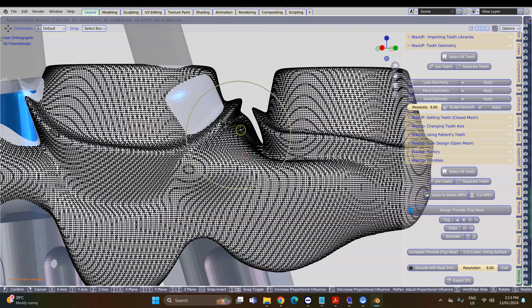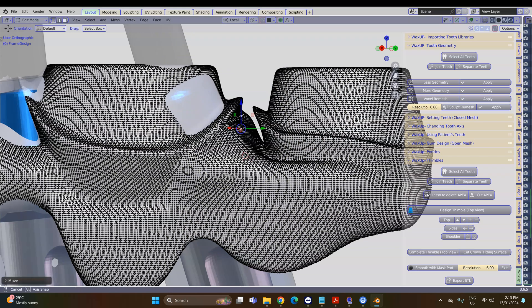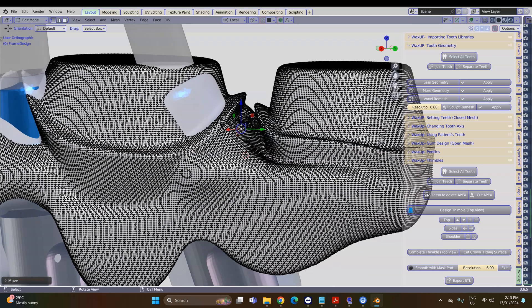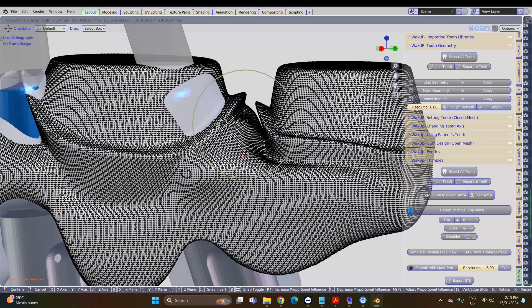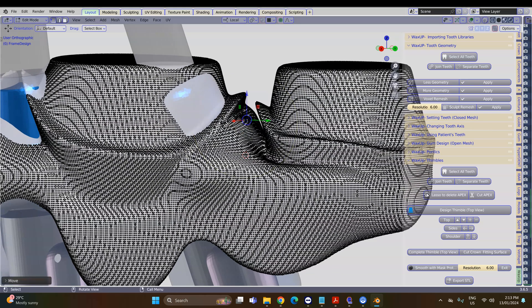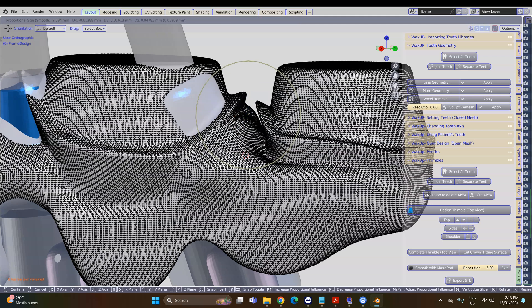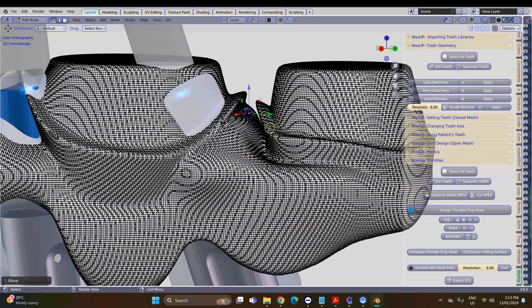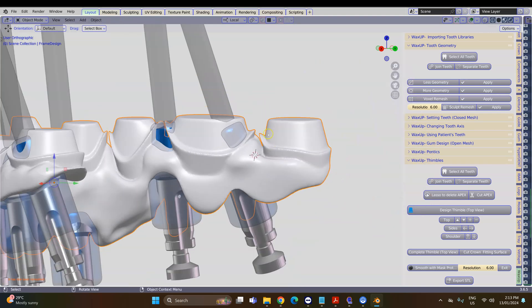The reason for that is because that implant is so very deep inside of this mesh. Usually this is not the case.